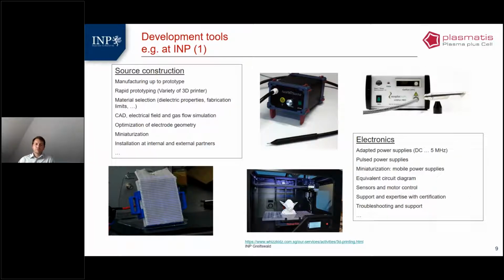And electronics, of course, always there's a power supply needed. Some tendencies go now to have one power supply and then adapt the connectors later on to these power supplies. So you only have to get the certification once, and in the next parts you have a very high level of input standards with which you go into the next round of certification.